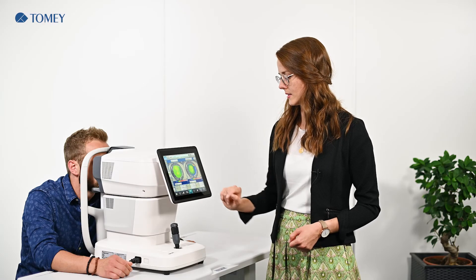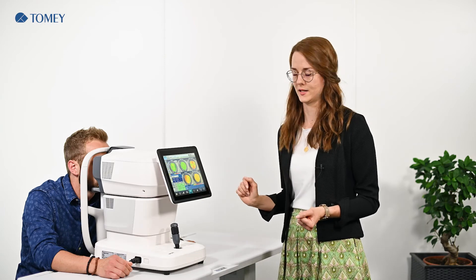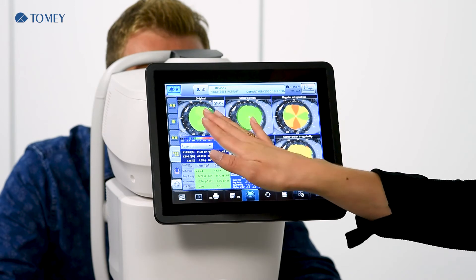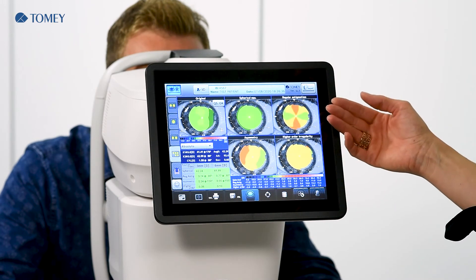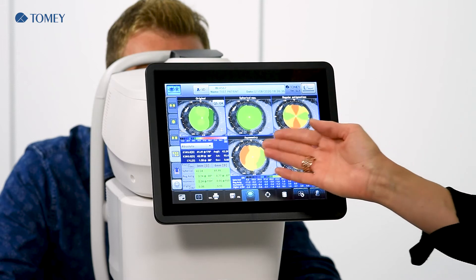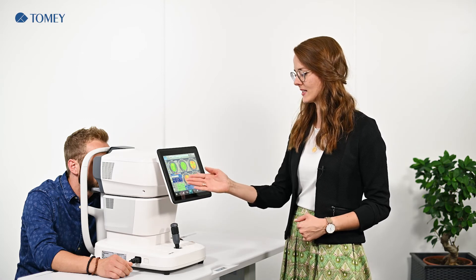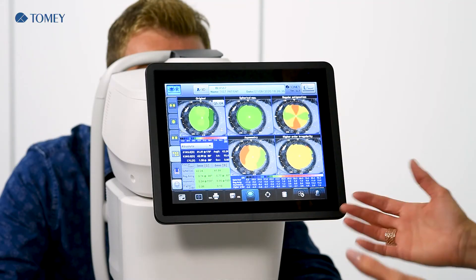Last but not least, we have the possibility to show a Fourier analysis. In the Fourier analysis you can see the original map, the spherical equivalent, the regular astigmatism and asymmetry, and also higher order irregularities. Any abnormalities would be highlighted in the chart in yellow or red color. In this case it is all green, so everything is supposed to be fine.